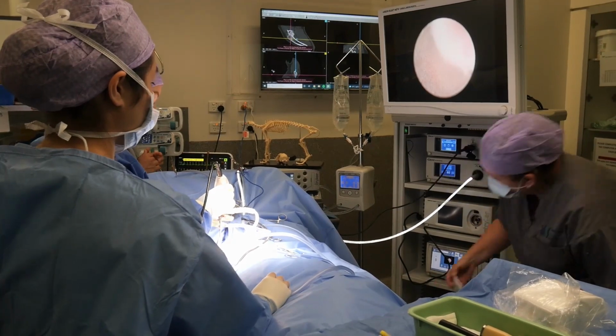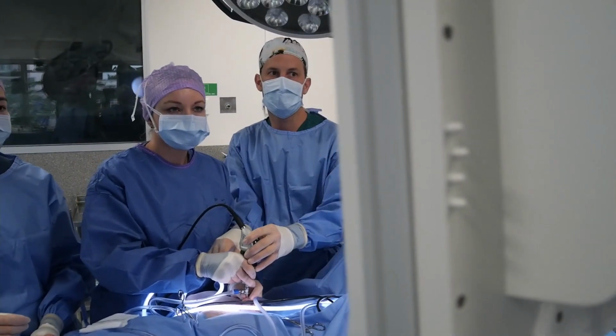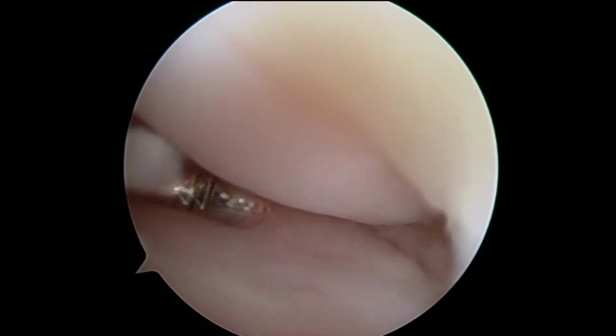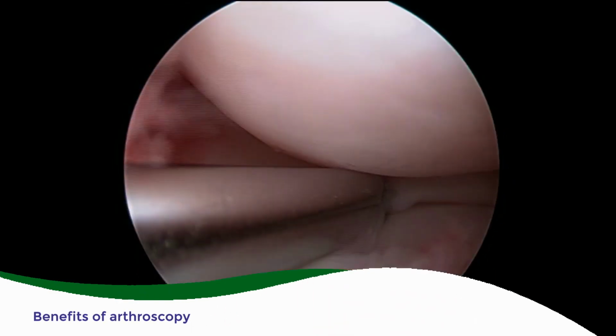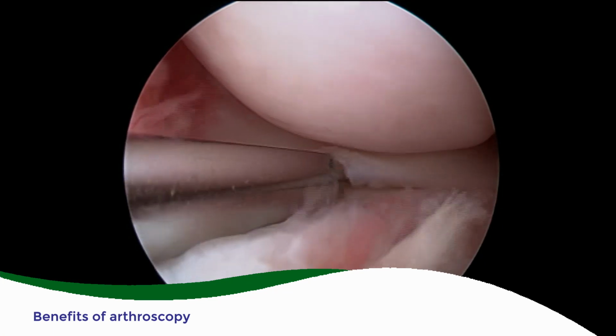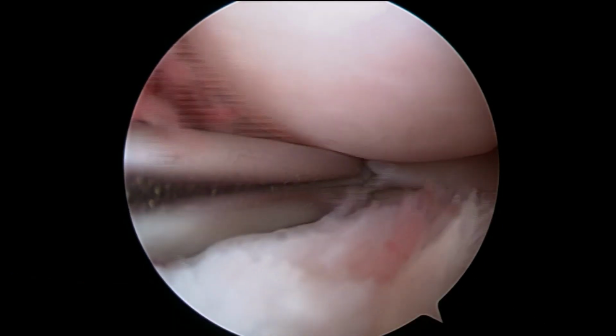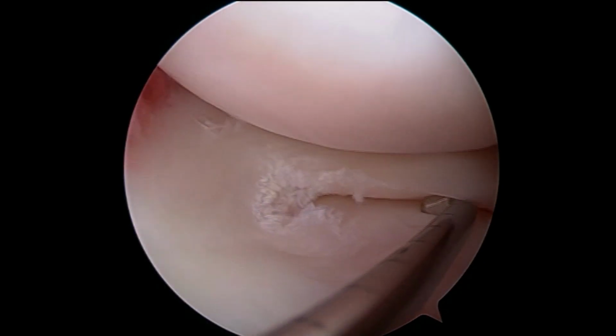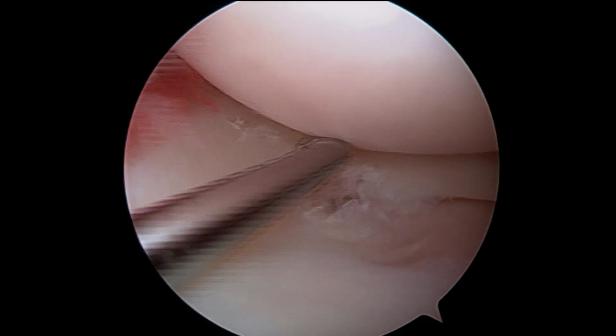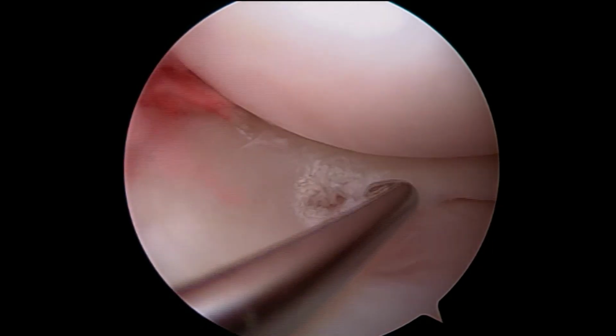So talking about arthroscopy in particular now, it is a procedure which involves a fibre optic camera which gets inserted inside a joint for two main purposes. So both diagnostic evaluation, but then also we can therapeutically treat your dog's condition at the same time. The benefits are that it involves very small incisions into the joint, so we do believe this reduces morbidity quite significantly to your animal. But also it allows a really superior diagnostic evaluation of what's going on inside the joint compared to if we were to open and look inside with the naked eye.